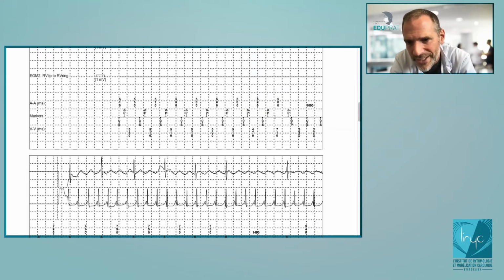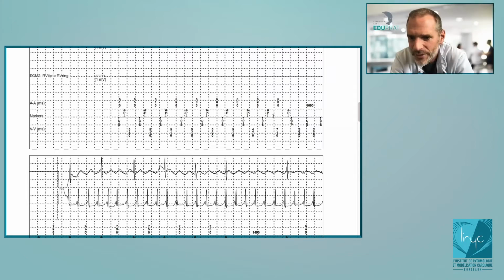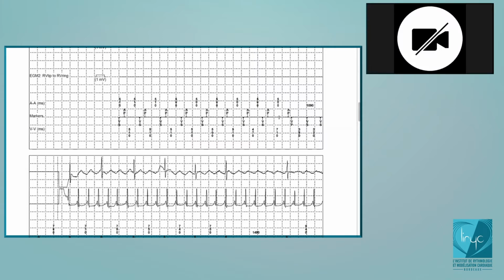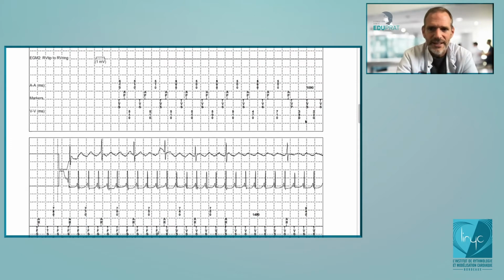But what it seems is that there is a blocked atrial pacing. You agree with that? Yes. No P wave at this time. So what happens here? If there is one blocked, then you will have AP-VP with the short AV interval of 80 milliseconds, okay? Yes. Because here the device is working with AAI-DDD, MVP. So blocked atrial pacing, short AV interval, and then a PVC. And then what happens?